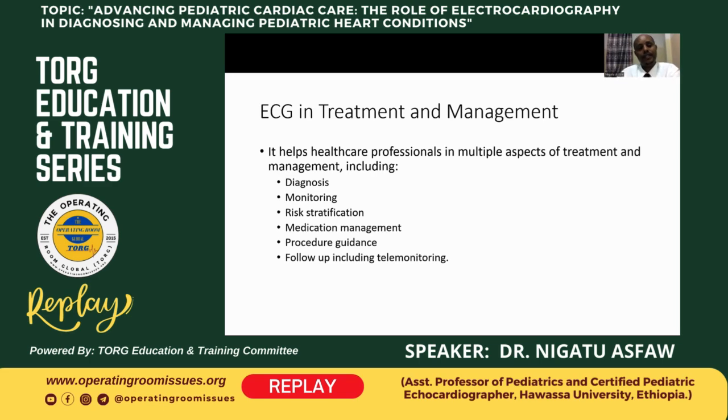And ECG can help us in the treatment and management of different conditions and diagnosis, in monitoring during treatment and after treatment, in risk stratification, particularly in sport participation, and in medication management when we administer medication which affects heart rhythm.